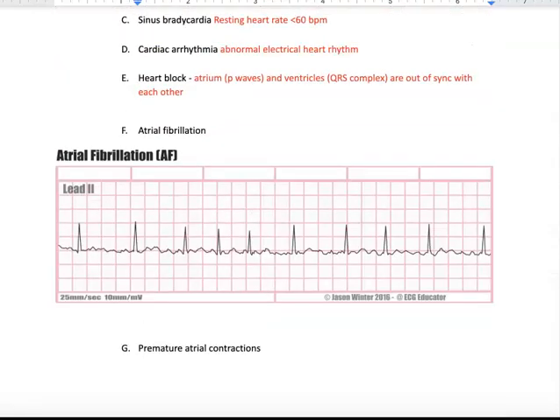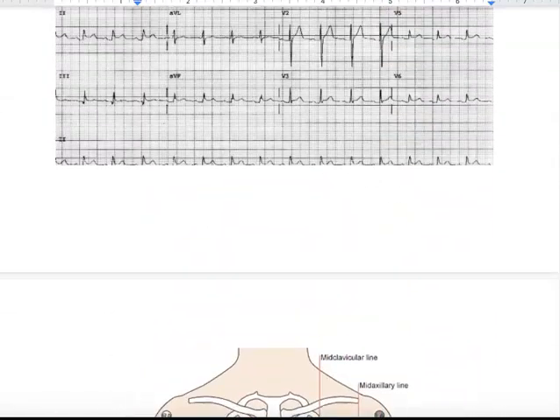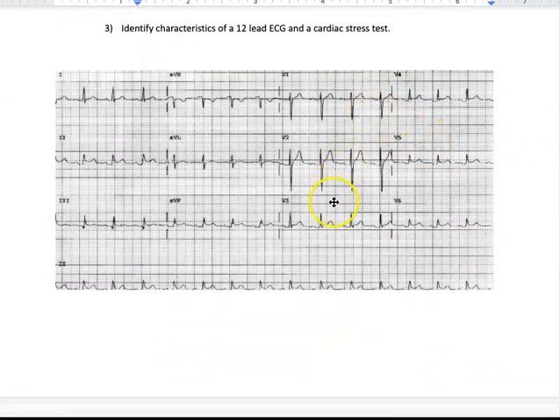You're not going to see ST segment depression in every window, but based on what window they see it in, ST segment depression with exercise can tell them where the blockages probably are. So let's say they start working and their heart rate gets up to 120 or 130 as they're walking on a treadmill, and you start to see ST segment depression in V5. That's going to tell you that the blockage is most likely in the vessels supplying the left ventricle.